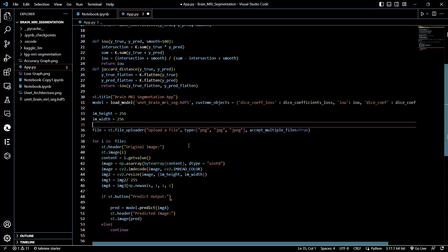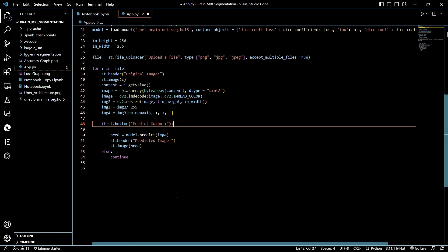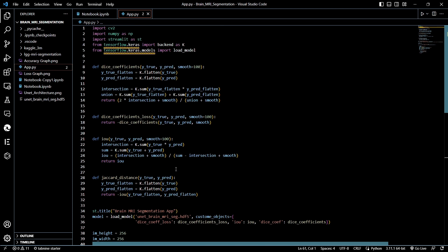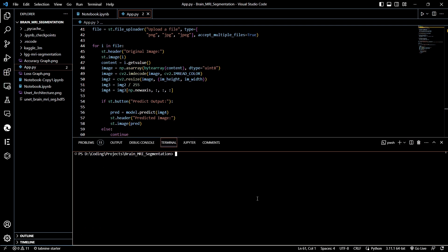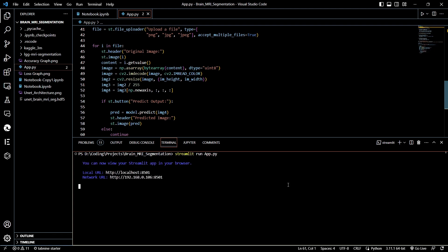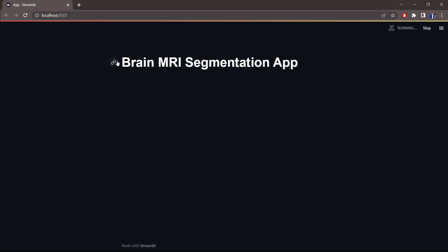That was the whole app.py code. Now let's save it with Ctrl+S and go to our terminal. To run a Streamlit app, make sure you are in the current directory where app.py is located, then type 'streamlit run app.py' and it will start running.